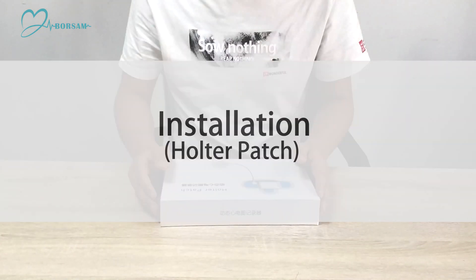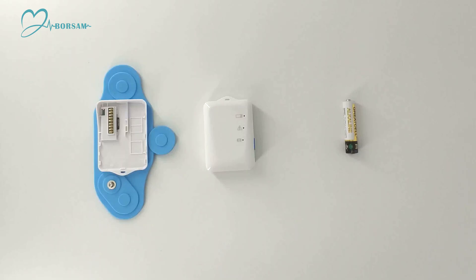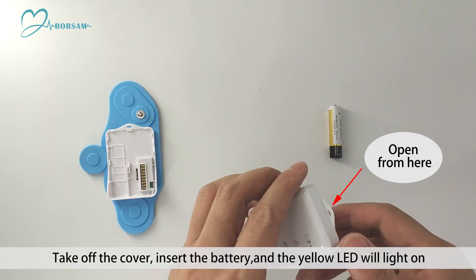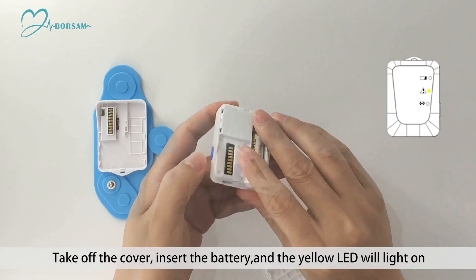Installation: Holter Patch. Wipe the skin with alcohol according to the electrode position. Take off the cover, insert the battery.